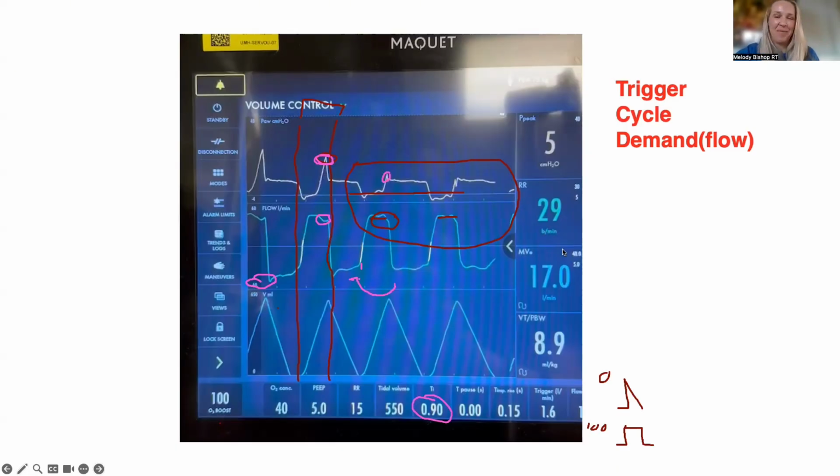I don't remember when I took this, but if it was a DKA patient or just any person with severe metabolic acidosis who has a tremendous minute ventilation, it's basically impossible to support them with the ventilator. You just kind of can't. It's never going to look good. You're going to break rules, because you're asking the patient to take care of that minute ventilation need through something that is certainly narrower than their trachea.